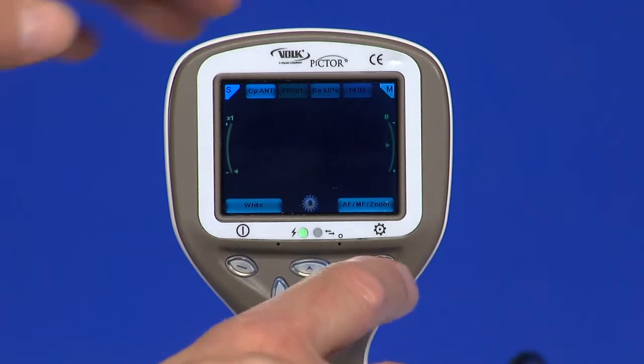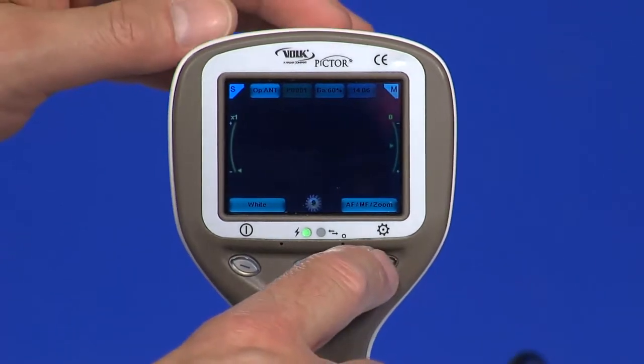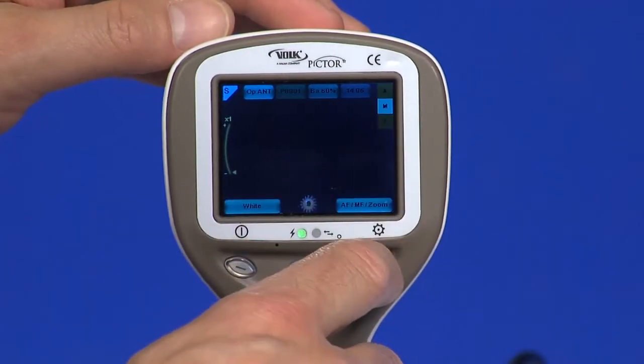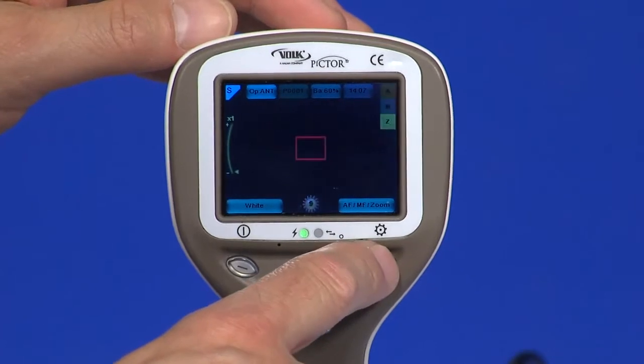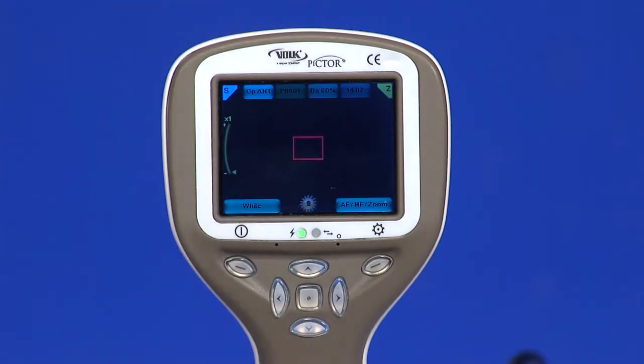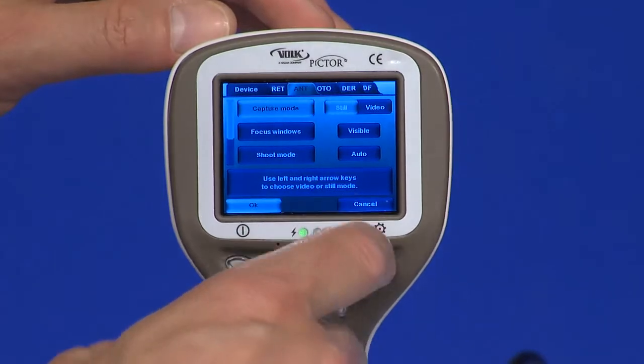There are two functions for the right soft key: switch between auto and manual focus, and press this key to activate the zoom function. Digital zoom can be used for close-up of features and image focus. The icon Z is displayed in the top right corner of the display when active. Enter the camera menu by pressing the right soft key for longer than one second.